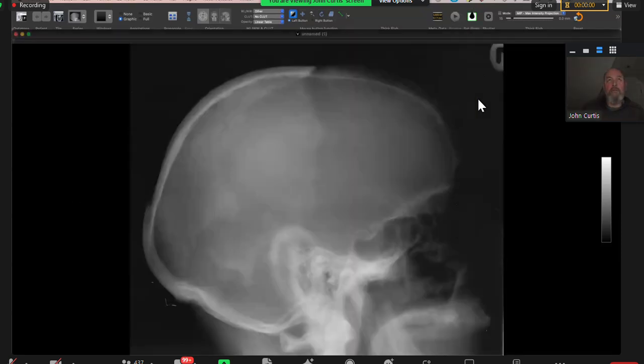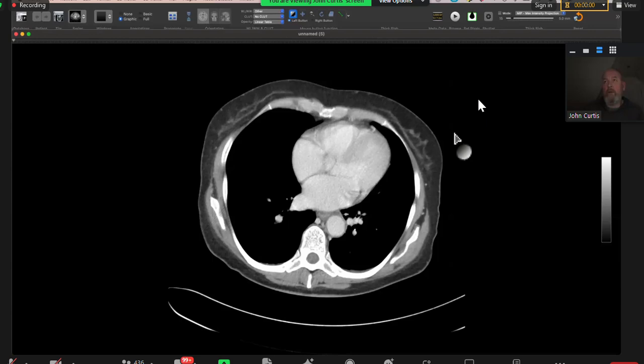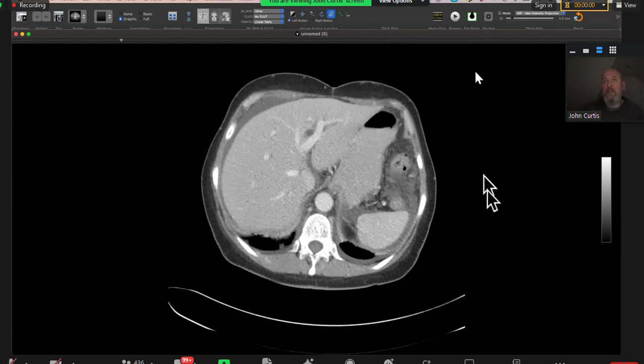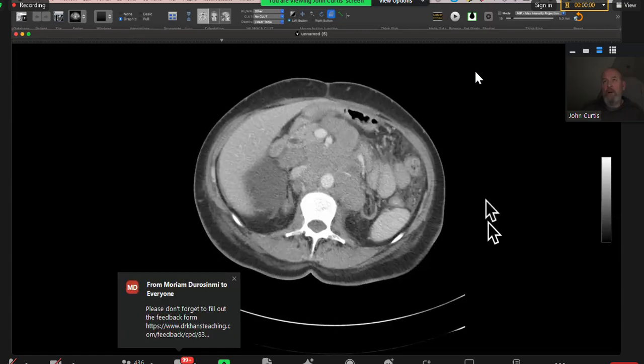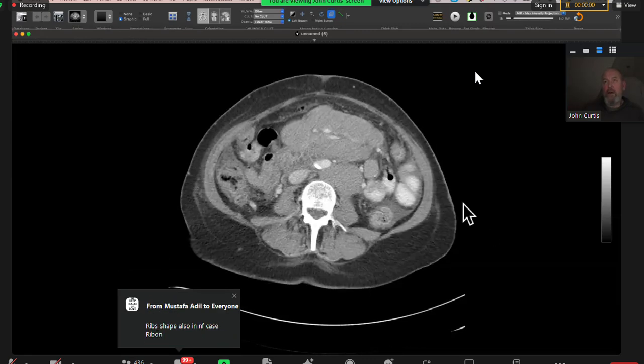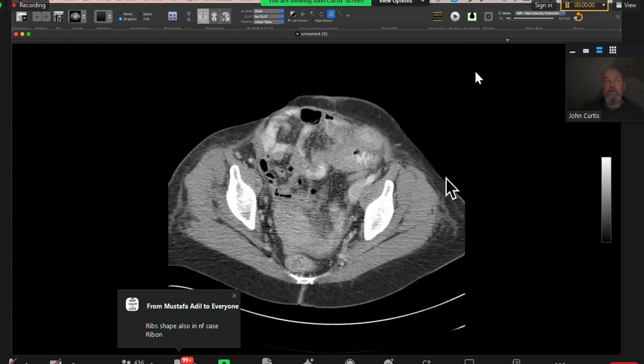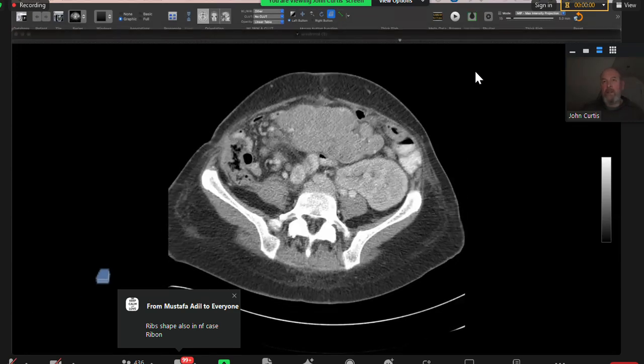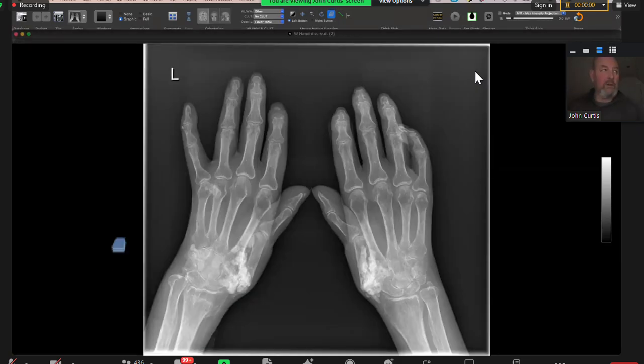Osteoporosis circumscripta, knock it for 6. Thank you. PTLD, you did really well on that one. So that's PTLD: ascites, retroperitoneal and mesenteric lymphadenopathy, thickened bowel loops, and transplant kidney. And then scleroderma hands, and you went through the lung and the esophageal dilatation findings, and then stress fracture. You did really well on that.